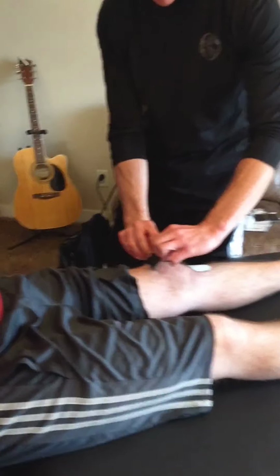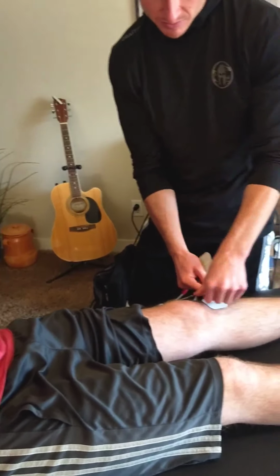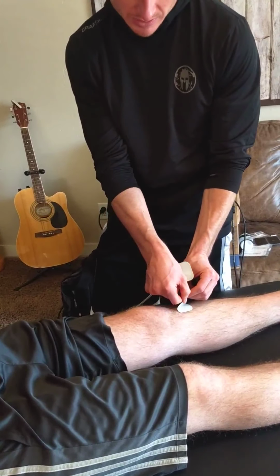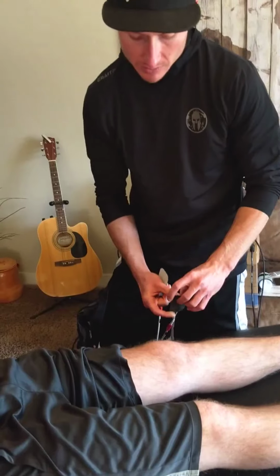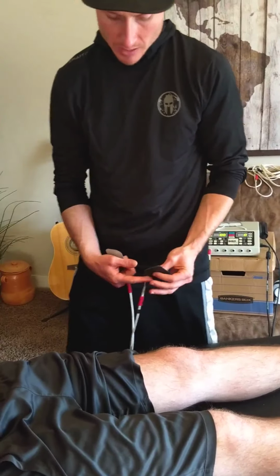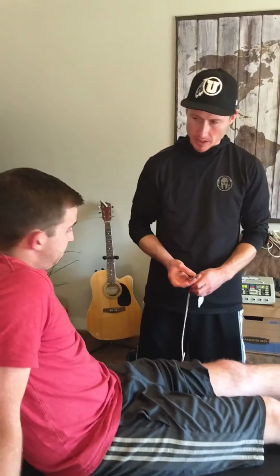Pull it off. All right, and I also want to check as we get this, just to make sure that nothing funky went on, and just make sure the skin looks good, which everything looks good here. So you should be good to go unless you have any questions for me, Hank. No, we're good. Awesome. Thanks. Yeah, you bet.